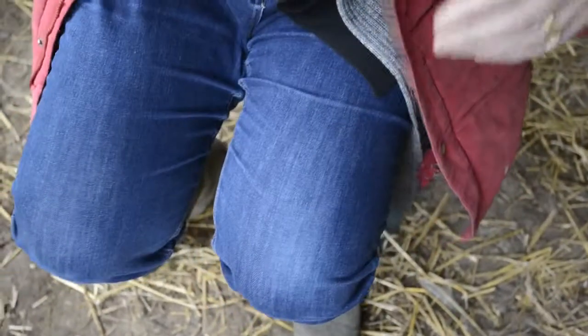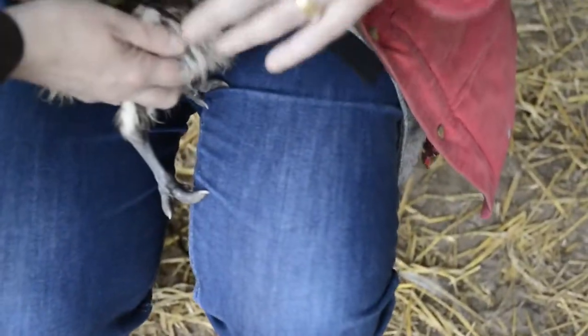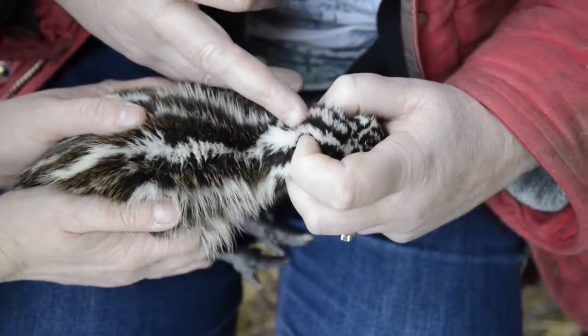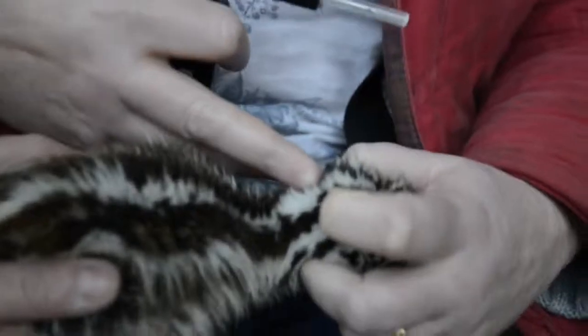Then we get the chick into position — it's helpful to have an assistant, as they've got quite strong legs. What I'm going to do is flex the neck slightly and isolate the pipping muscle, which is here. You can see it quite prominently — it's at the base of the neck, slightly to the left hand side of the chick.